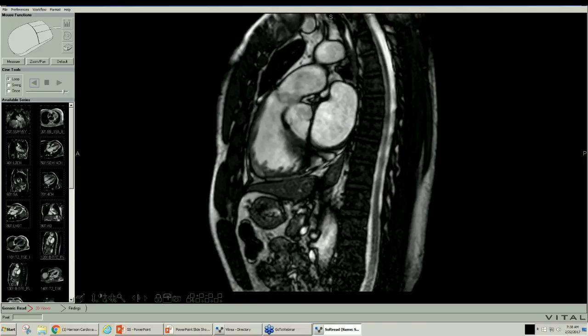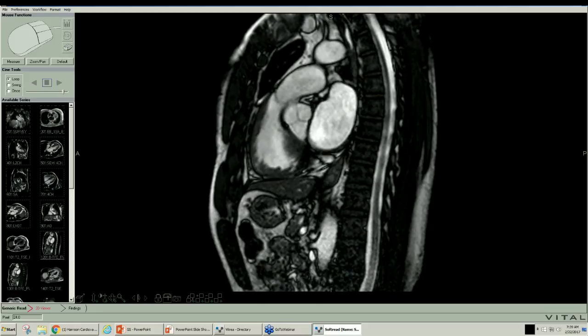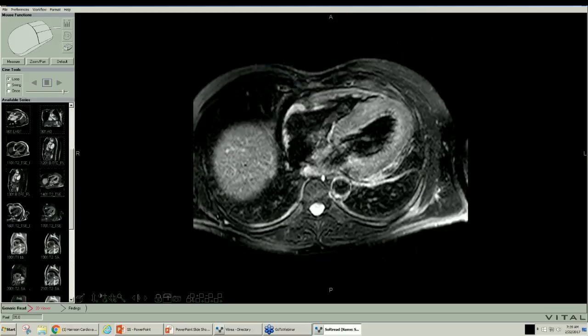Right ventricular outflow tract. It's a good chance to look at the right ventricle and decide about the thickness. And so if you get sort of off the trabeculae, see what we can measure in right ventricular thickness. For me, if you can measure it and it's got something measurable, it's abnormal, because usually it's so thin, like the pericardium, it's not measurable, and so that's abnormal.